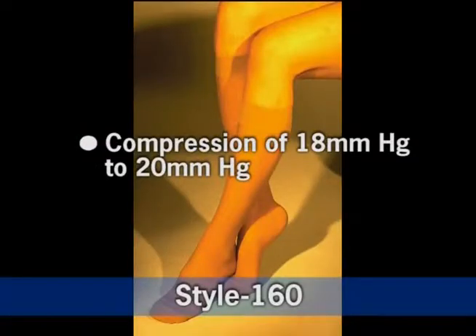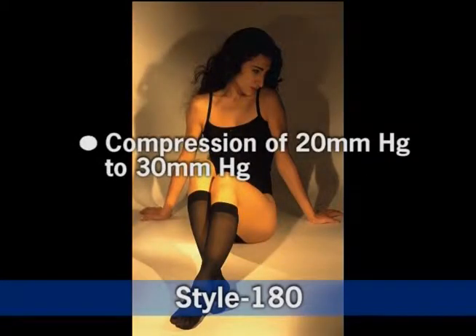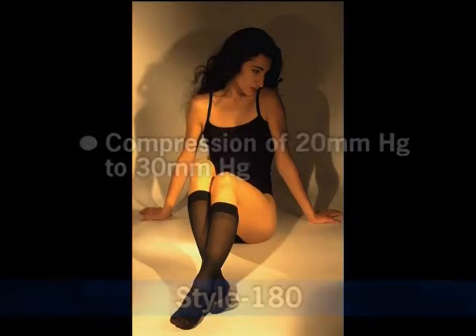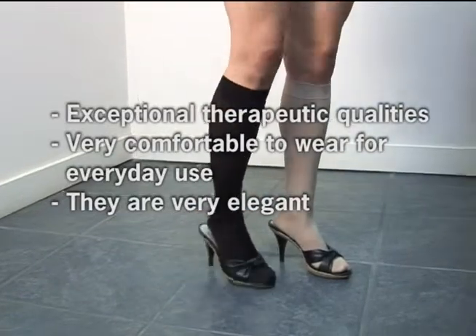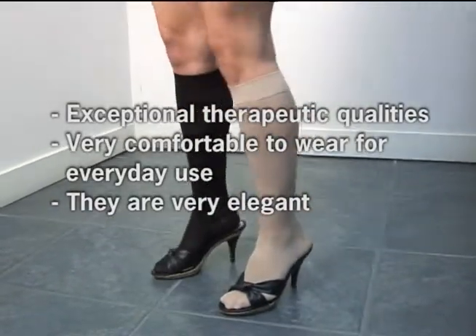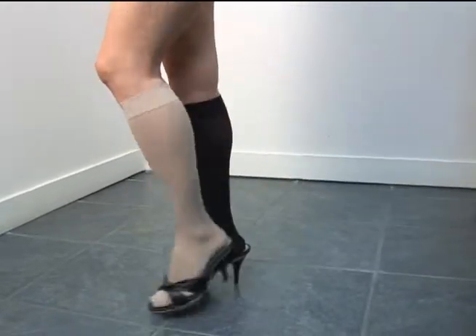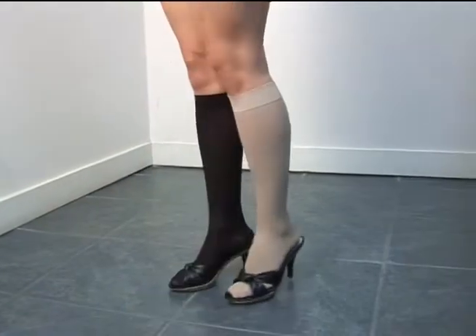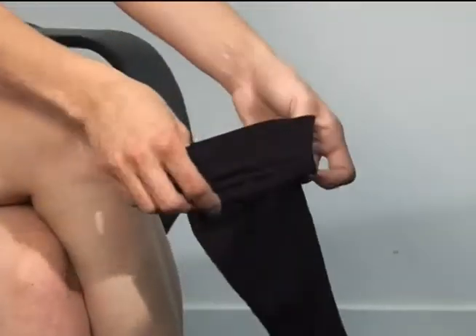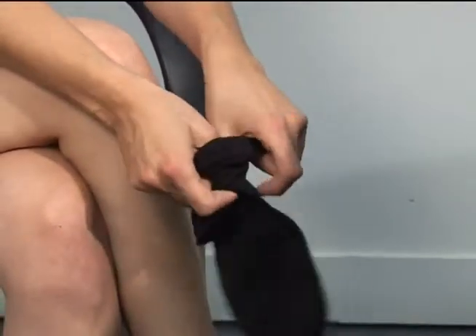Style 160 comes in compressions from 18 to 20 millimeters mercury, and our Style 180 comes in compressions of 20 to 30 millimeters mercury. ITA Med compression hosiery has exceptional therapeutic qualities, are very comfortable for everyday use, and are very elegant. The stockings have been designed for women with a sheer design, and they were designed for prevention and treatment. They come in beige, nude, and black.